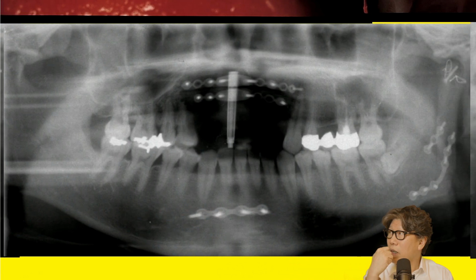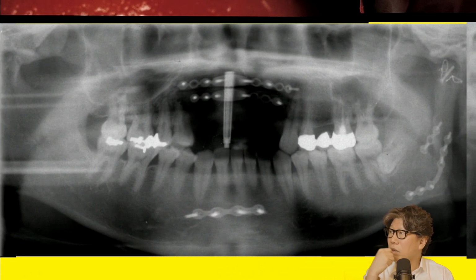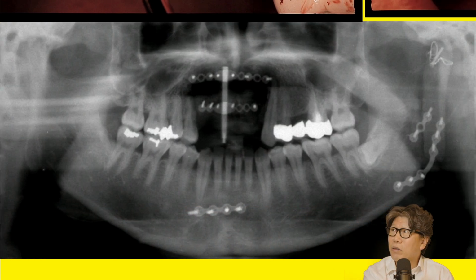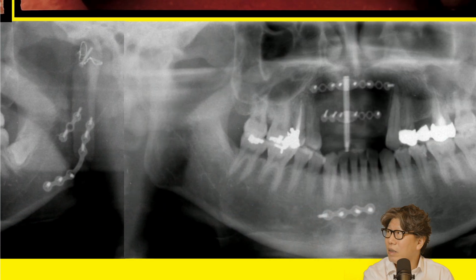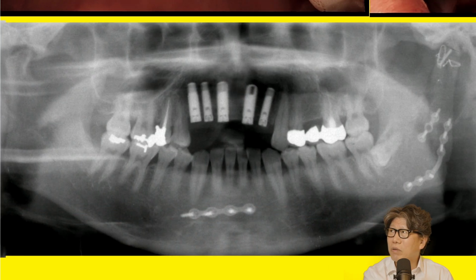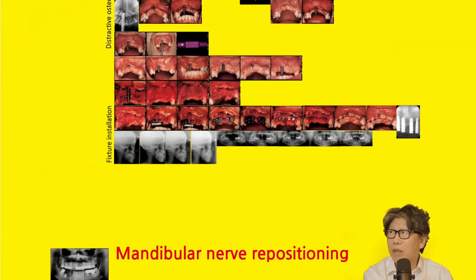So this is what it looks like. I'm sorry this is a little bit of a bad slide. It's an analog panorama, no more digital. That's why I spread it out this much. I can't do it now. I just plant it deeper down, which is a little harder to do now.